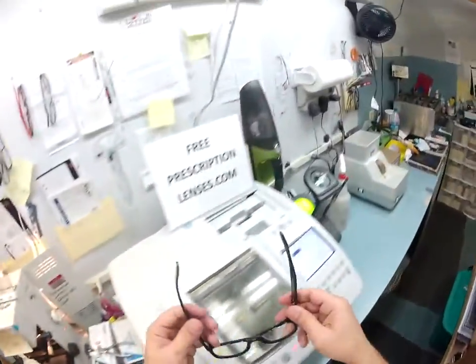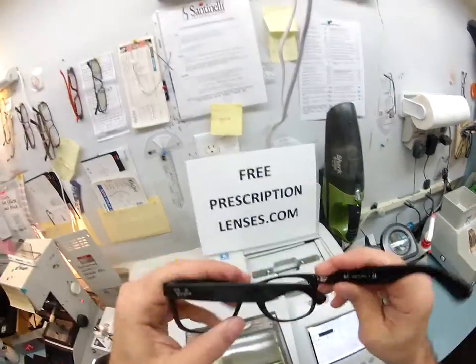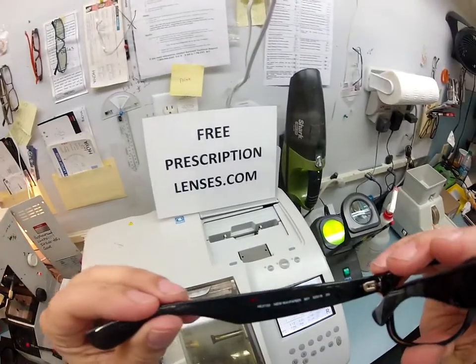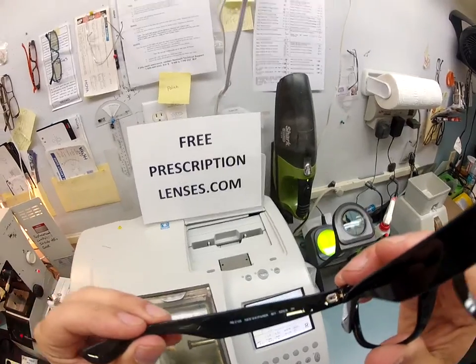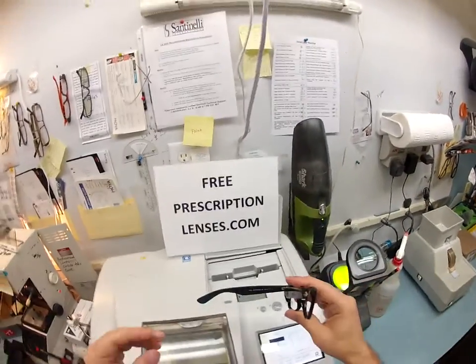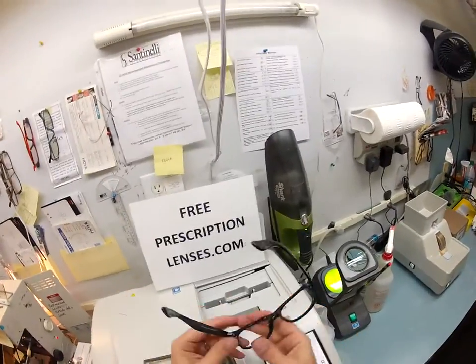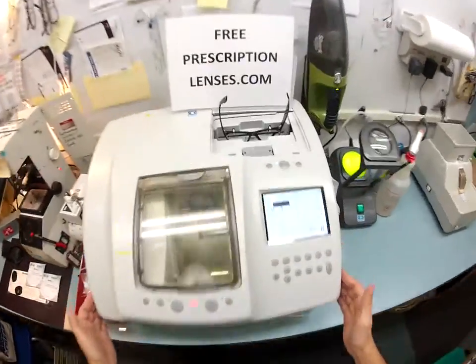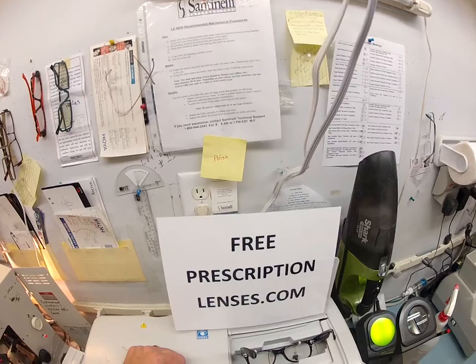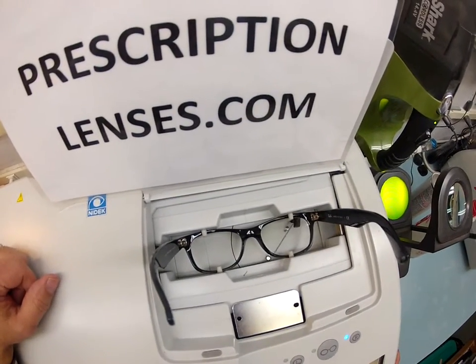Here's your G15 lenses on the counter. I'm going to put your Italian Ray-Ban 2132 New Wayfarer, size 52-18, color 901, into my Italian Santinelli LE 1000 patternless edger here at FreePrescriptionLenses.com, where everyone loves a bargain and no one is disappointed with quality.